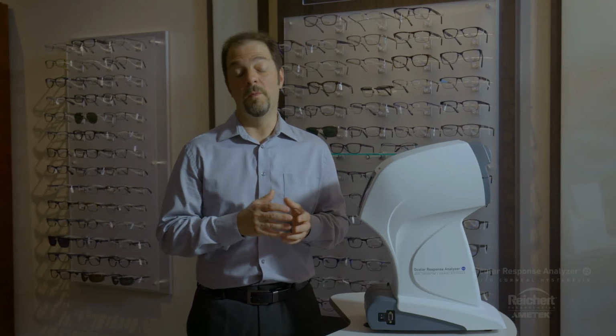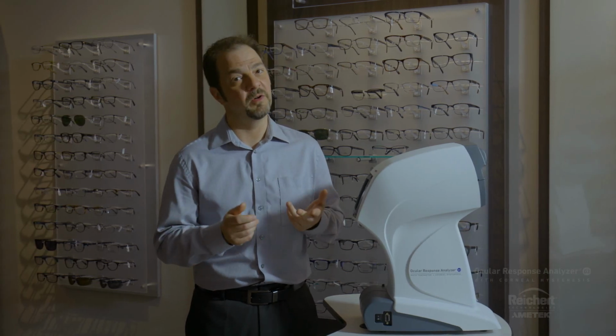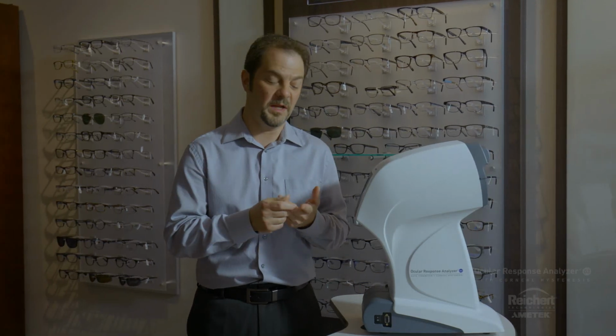Now there's always going to be some examples where this device doesn't agree with the Goldmann, and it might be by a considerable amount. And that's usually attributed to perhaps postural changes in the patient. Don't forget, Goldmann is a very subjective method of tonometry. Two different Goldmann operators will give you two different answers as to what the pressure is in any particular patient's eye at the same point in time.